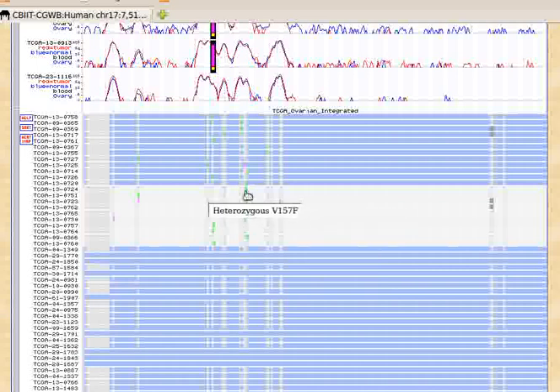And we can see some of these copy number neutral, like in this case, the copy number is 2.02, and we have a homozygous allele, and clearly there's a copy number neutral LOH that leads to selection of the mutant allele in the tumor sample.